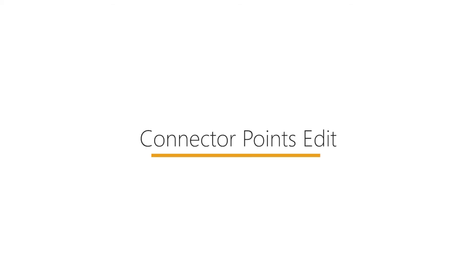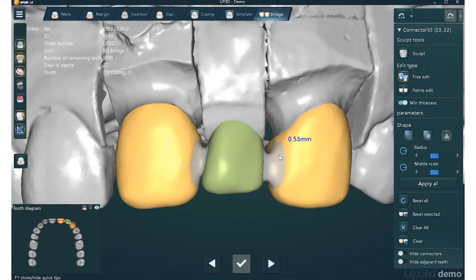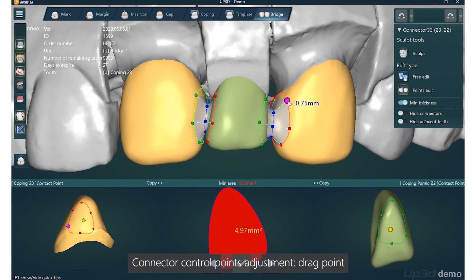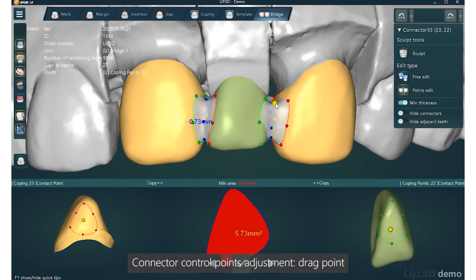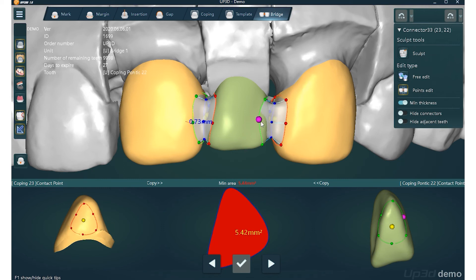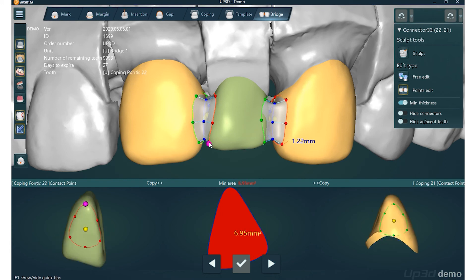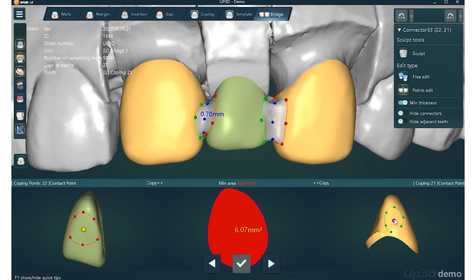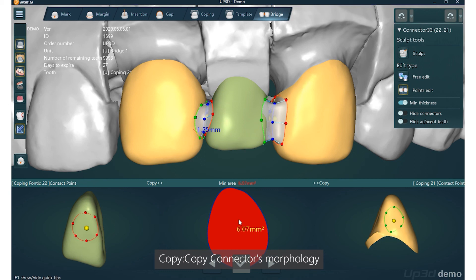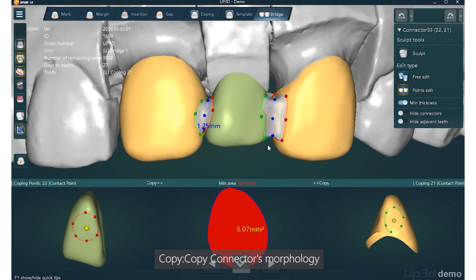Connector Points Edit: you can use Points Edit to fine-tune the connector after finishing the free edit. Two connector editing windows and a 2D cross-section preview window will be displayed at the bottom of the screen. Drag the connector control points on the main interface or the connector editing window to get the required shape. After editing one side of the connector, you can use the copy button to apply the same editing to the other side.